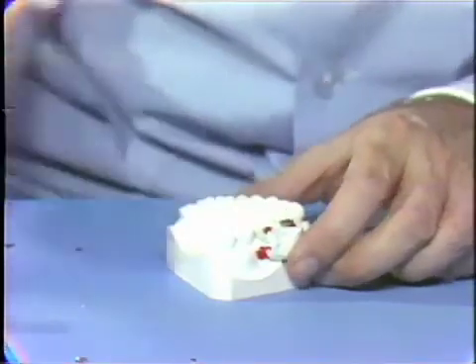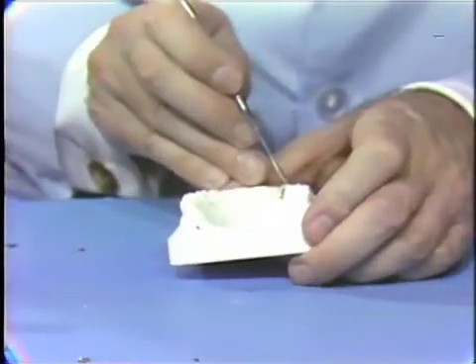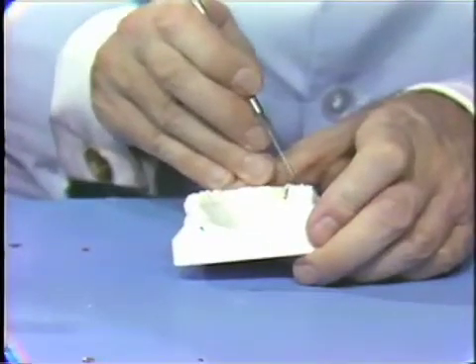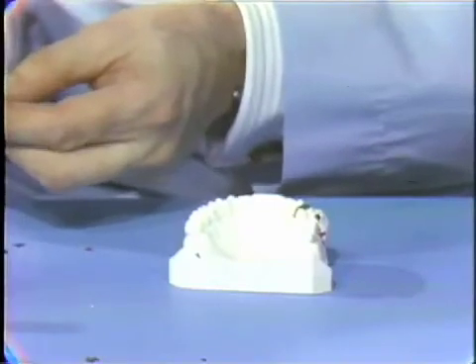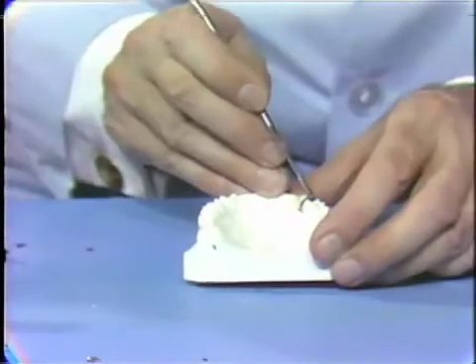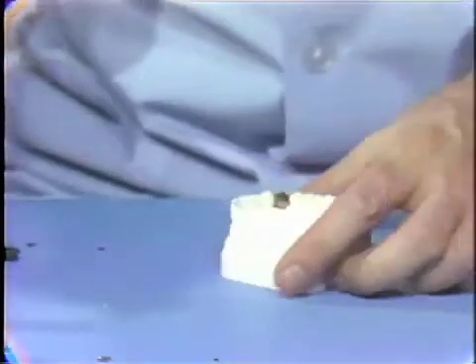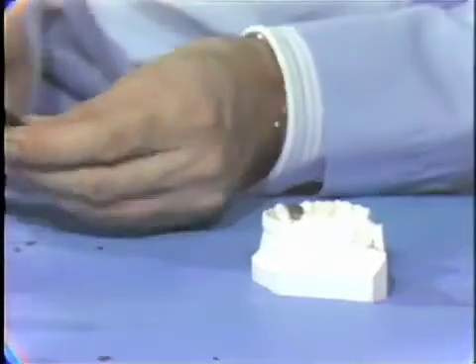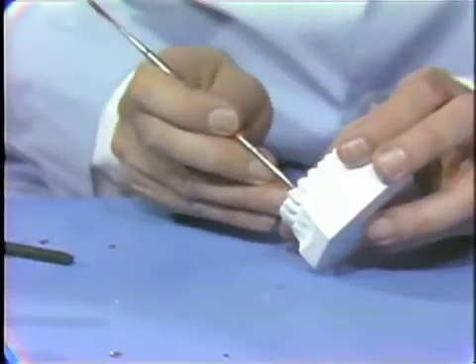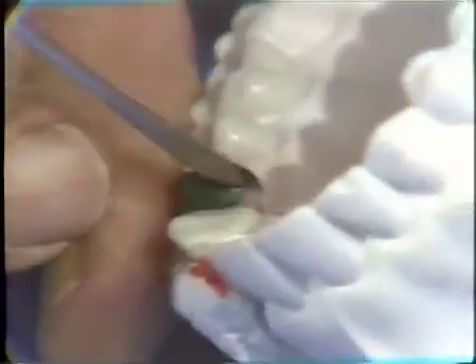Now wax has to extend beyond the occlusal surface down into those proximal bevels which we had cut on there. And it extends over onto the lingual to cover over the keyway in that bevel that we made going around the lingual surface.